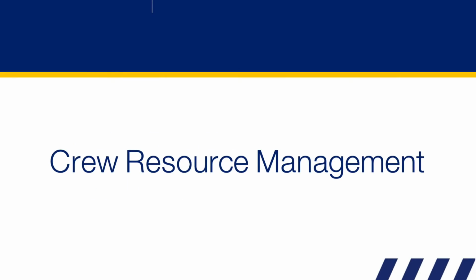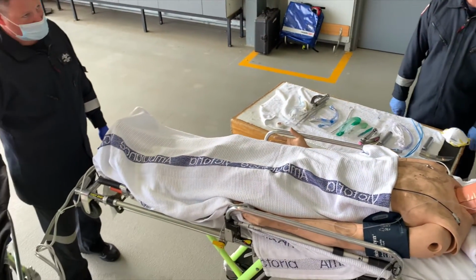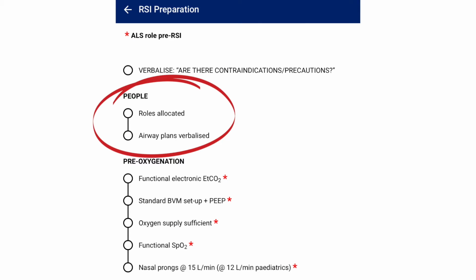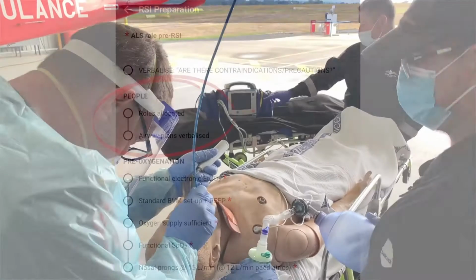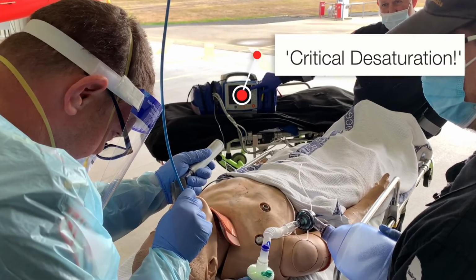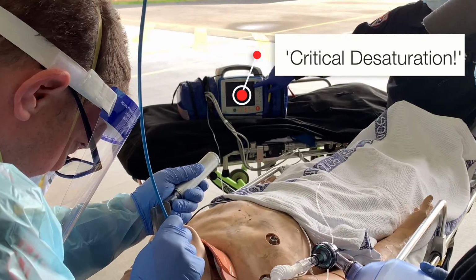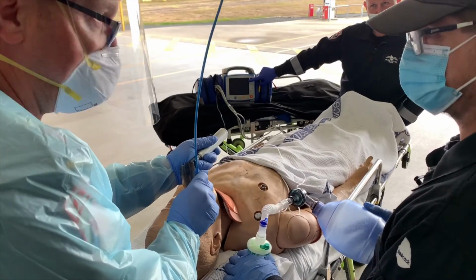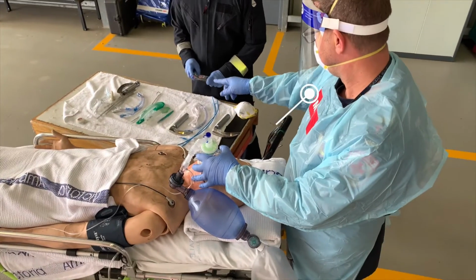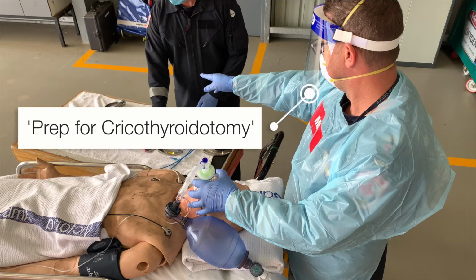Although cricothyrotomy is a critical task requiring rapid intervention, it's important the team is involved and an airway assistant is allocated by the lead clinician. In RSI, roles should be identified during the brief. If a CICO situation evolves, anyone within the team can verbalise this, clearly stating that CICO has developed. If CICO is called, the team must immediately address this statement and identify if this is indeed the case. Once a CICO situation has been identified, the lead clinician will undertake the procedure and provide a rapid brief, if not already done.